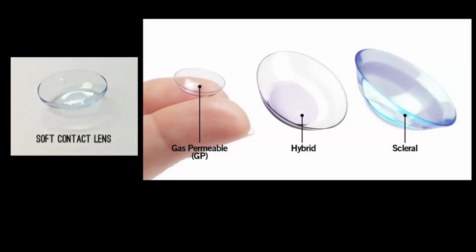Now, because of the discomfort from the RGP, there was a need to produce another contact lens that can give the comfort which the RGP didn't give, by having a skirt around the edge of the RGP, or the edge of a hard contact lens, because that was the challenge initially, right?